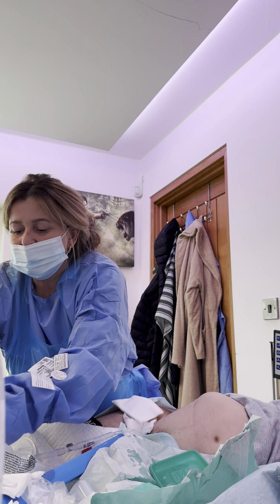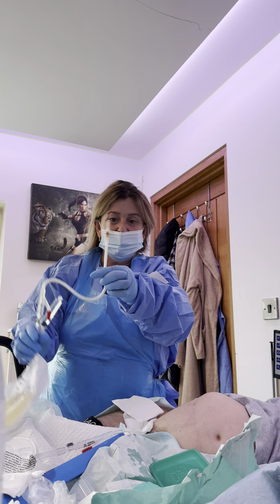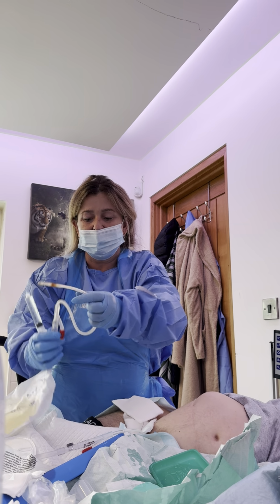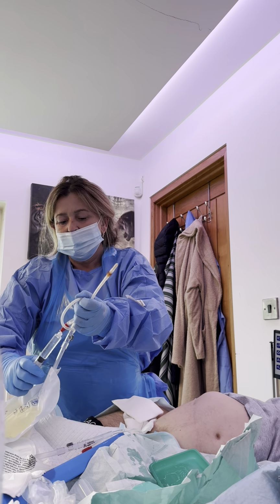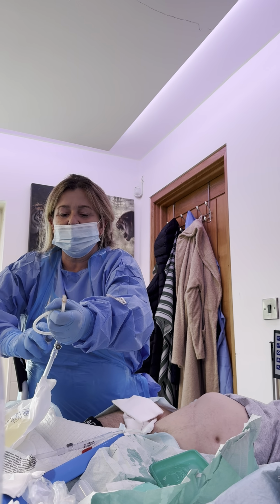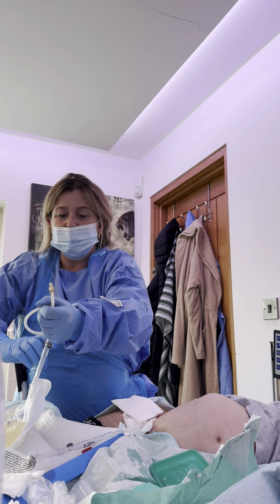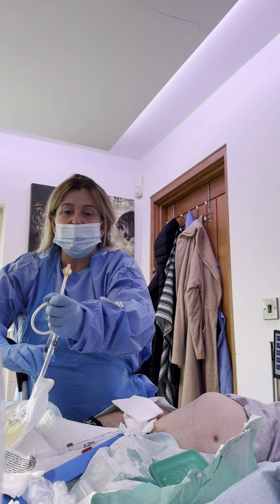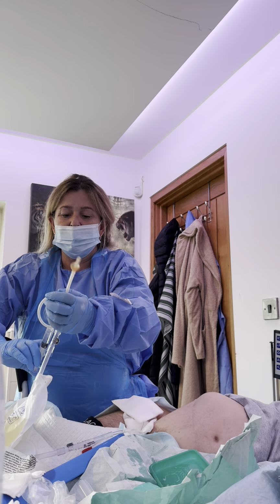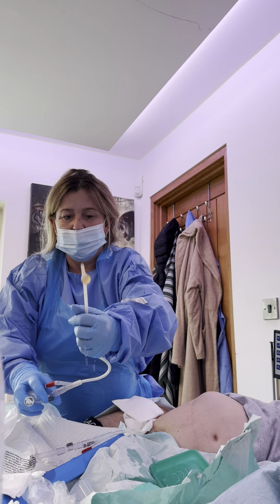So now what I'm going to do, which is disgusting, is show you this disgusting balloon. Keep your face and everything away from it because it has got infection around it. It stinks. Ben's not infected, it's the balloon. This is the faulty balloons that we keep having. Oh shit, I've never seen it come out brown in this one. No?